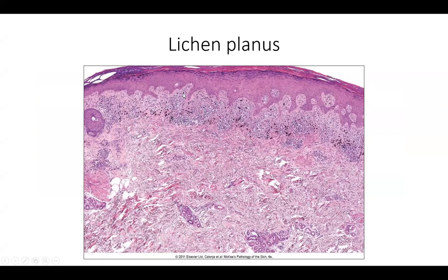Another example from McKee's pathology textbook shows a lichenoid inflammatory infiltrate where the dermal-epidermal junction is not as heavily obscured. You can still trace the rete ridges taking on a sawtooth morphology. From low power you see the band-like shape of the lymphocytic inflammatory infiltrate with scattered melanophages. There are areas where lichenoid inflammation interacts directly with the overlying epidermis.